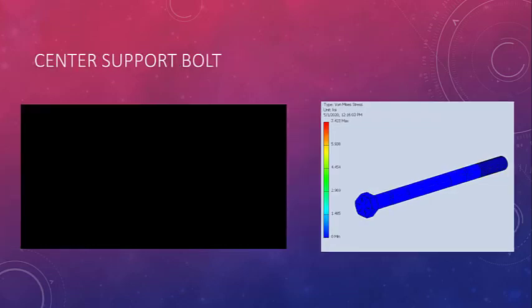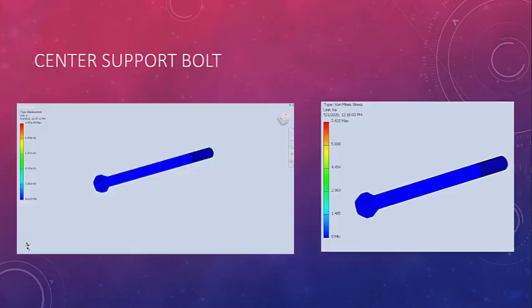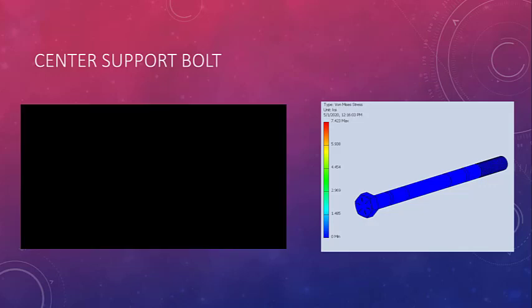As seen here, the center support bolt also held up fairly well. The displacement of the bolt at its max, while under the force of 400 pounds, was also under the thickness of a sheet of paper, coming in at 1/100,000th of an inch. The stress on the part seen to the right came in at a max of 7.423 KSI.